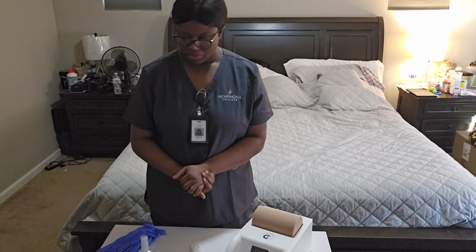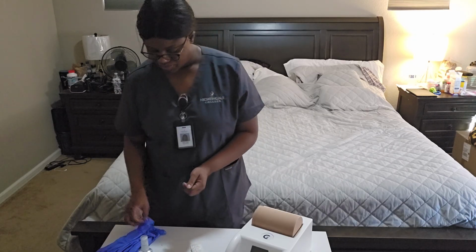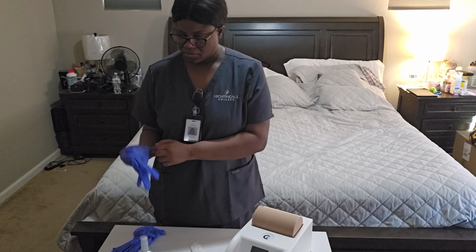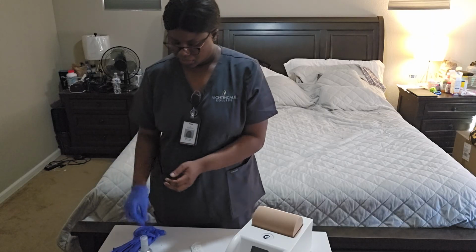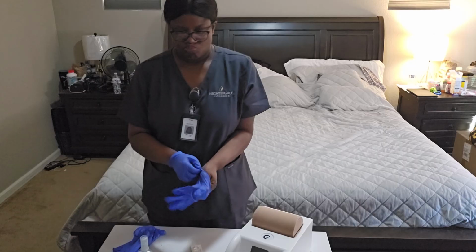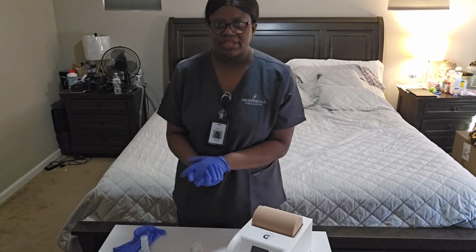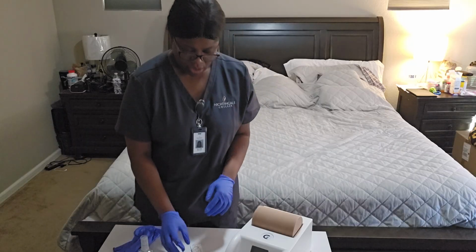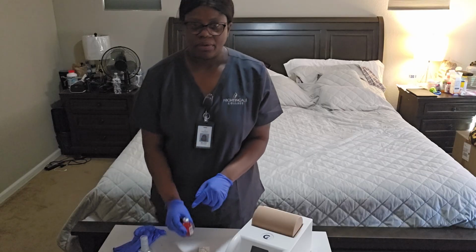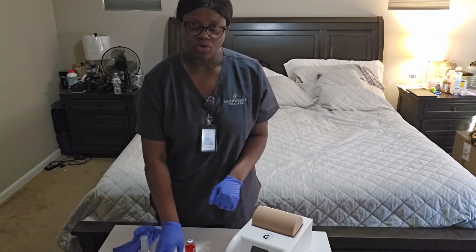So what I'm going to do next is perform hand hygiene. I'm going to put on gloves. The next thing I'm going to do is clean the top of my medication. I'm going to clean it with an alcohol swab.